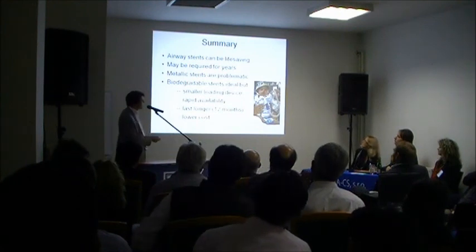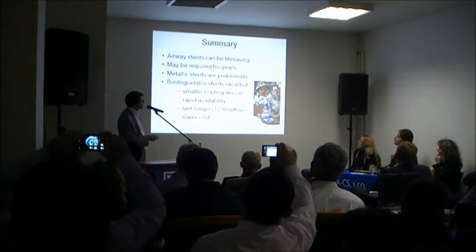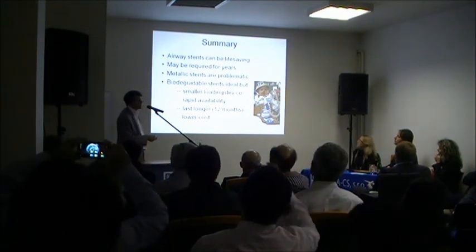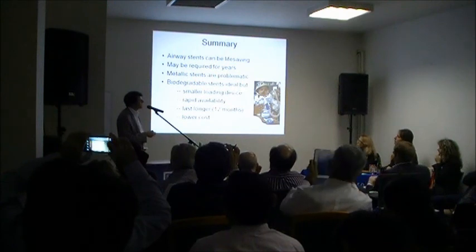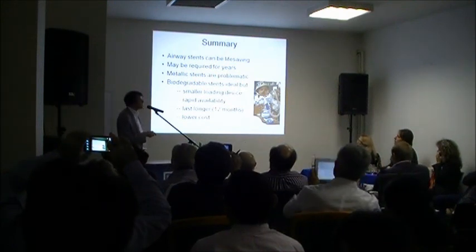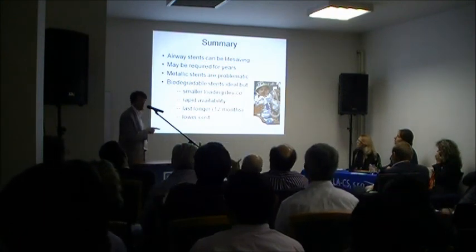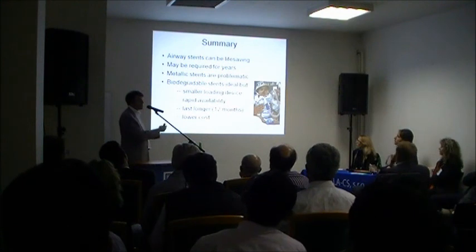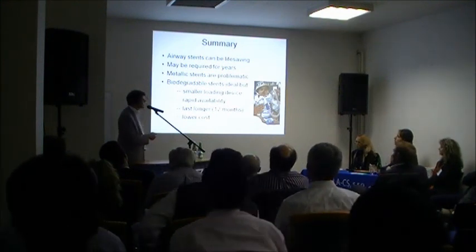So this is the patient here with bilateral stents ready to go home. He's on a portable ventilator, but he will have a good quality of life. The question now we face is he's had 4 stents put in. Where do we go next? Because he will take about 2 to 3 years to outgrow his bronchomalacia, because he has Down syndrome, and there's quite a delay in cartilage development. So I think those are the main issues we face now.